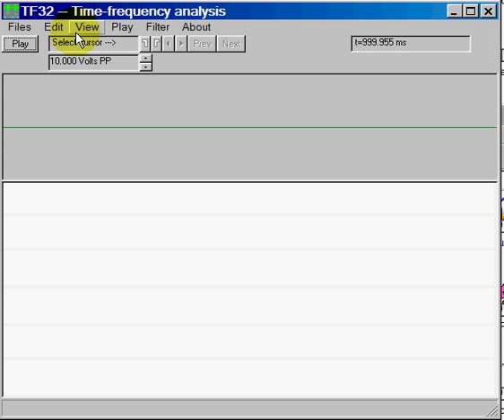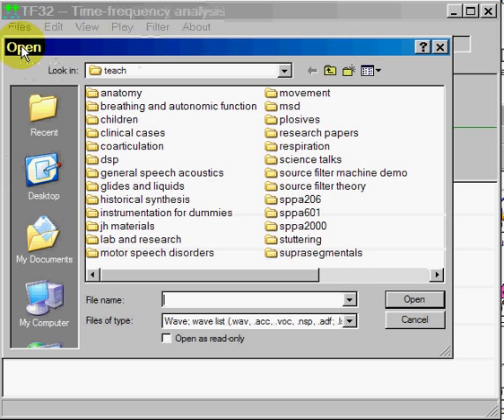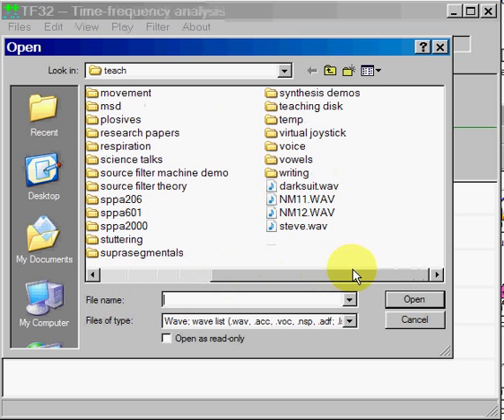The first thing we want to do is to load a sound file so that we can then do some basic visualization and manipulation. So we go to Files > Open, and you look around and find a sound file that you're interested in displaying.